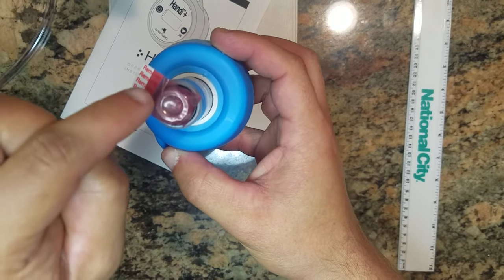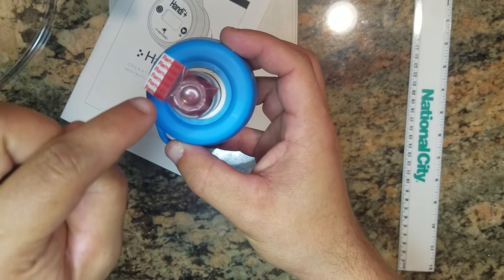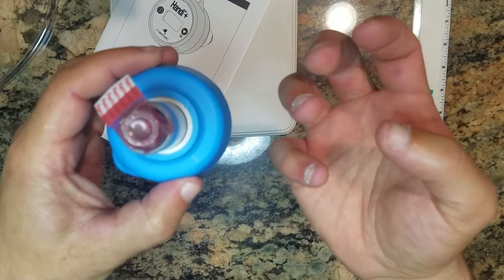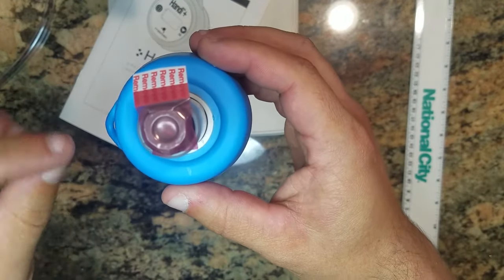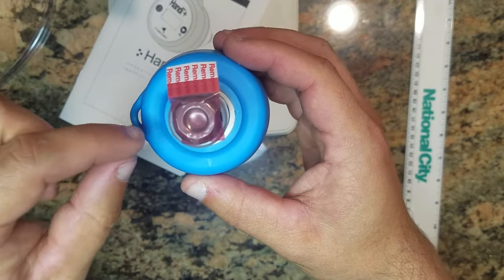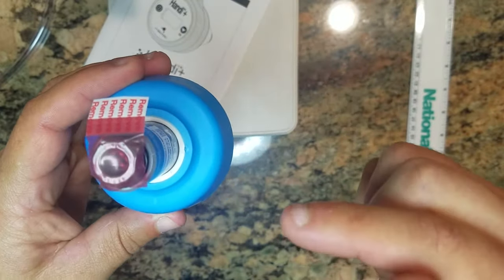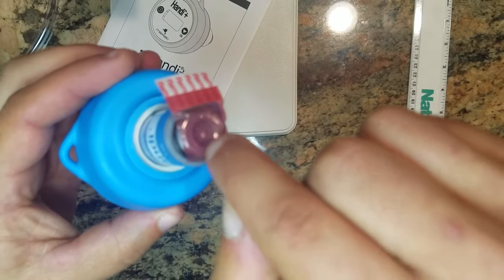Here's the instrument. It comes with tape over the inlet port — you want to leave this on until you're ready to use it. The sensor has a ppm life on it, meaning the more gas it's exposed to, the shorter the life of the instrument is going to be. So until you're ready to use it, leave this tape on.